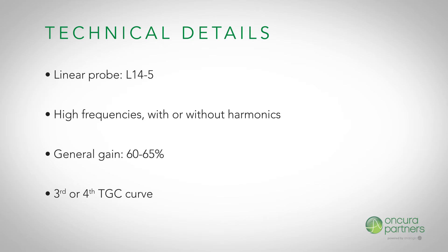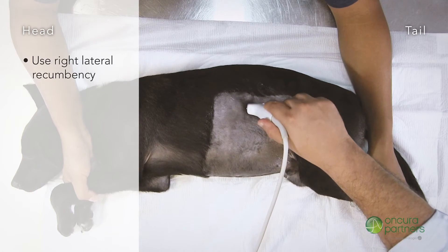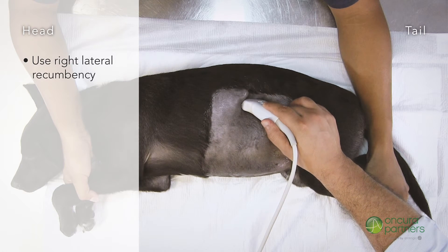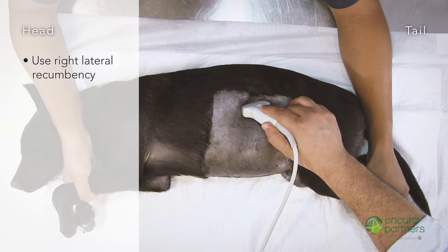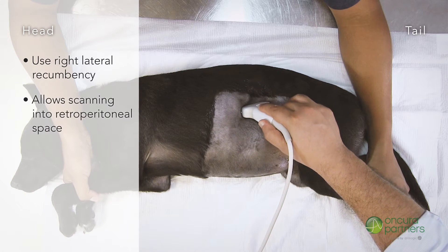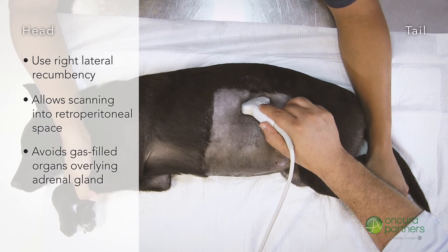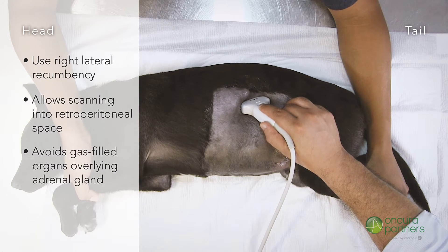Place the patient in right lateral recumbency with its legs directed towards the sonographer. This position provides a number of benefits when locating the left adrenal gland. Firstly, it will allow the sonographer to scan dorsally into the retroperitoneal space. Secondly, it will help to avoid the gas-filled colon, small intestine, and splenic body, which overlies and can interfere with visualization of the left adrenal gland.